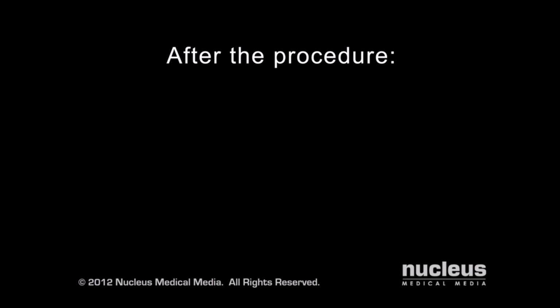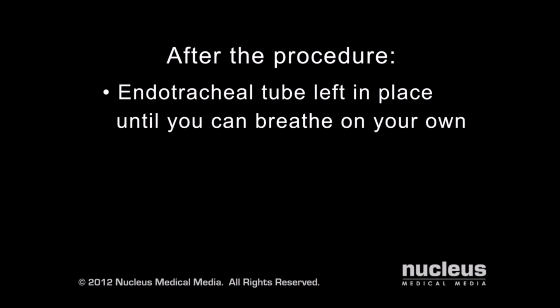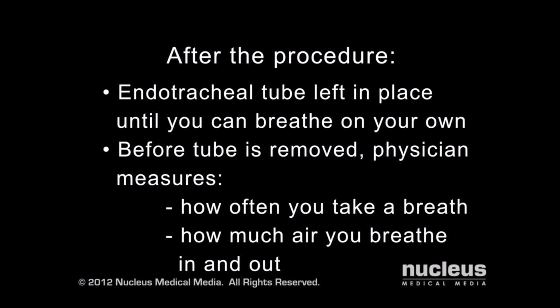Once your surgical procedure is complete, your doctor will not remove the endotracheal tube until you are able to safely breathe on your own. He or she will make this determination by measuring how often you take a breath and how much air you breathe in and out with each breath.